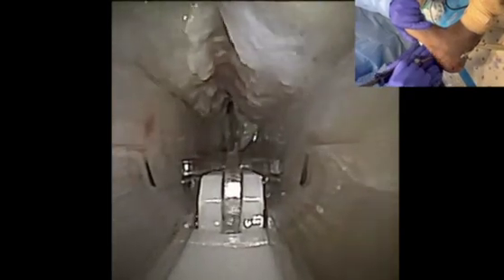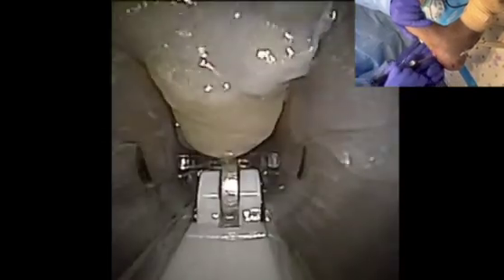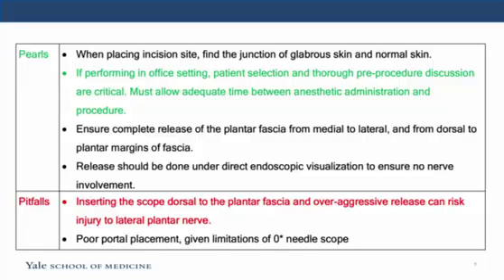A bulky, sterile, soft dressing and a postoperative shoe is applied. The patient is made protected weight bearing on the operative leg for 2 to 3 days and then progresses to weight bearing as tolerated once the sutures are removed.